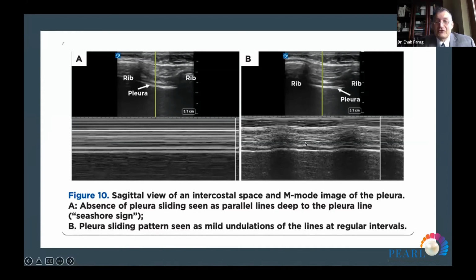You can use that for pneumothorax and also when you use it for double lung or single lung intubation, when you are clamping the right or the left, you can put the ultrasound and see whether there is movement or not. And this is a confirmation, and we use that very nicely during our one lung ventilation. We use ultrasound for confirmation after we use the bronchoscopy for proper positioning. And especially during surgery, you can put the ultrasound to confirm that you still have one lung ventilation.